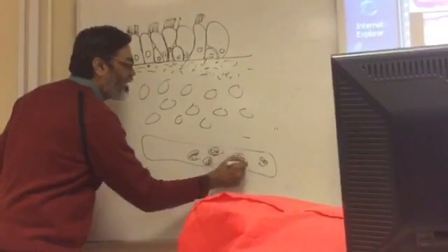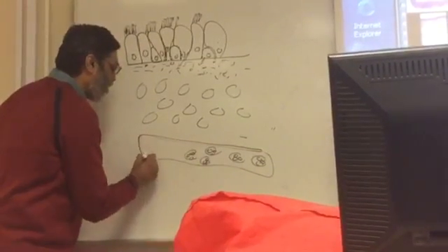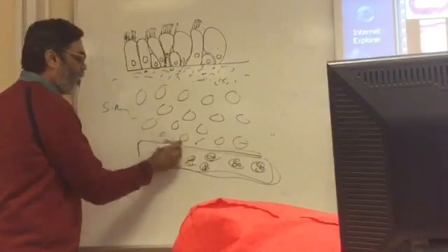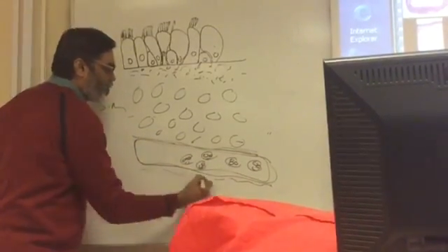You can see this is hyaline cartilage, and the perichondrium here. This perichondrium of the cartilage fuses with the connective tissue of the submucosa. So they fuse together here. And then outside we have again connective tissue.